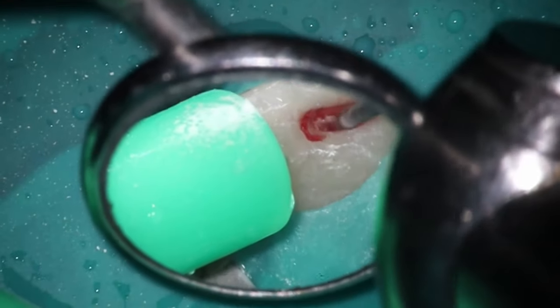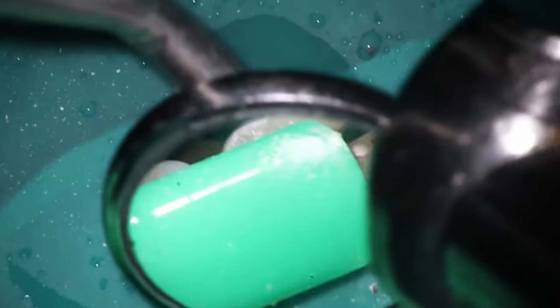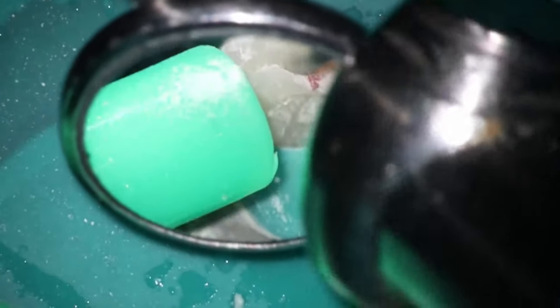And yes, I have been playing around with fusion. So here's what that looks like. You can see nice healthy tissue. It's not bleeding too much. You will notice it's not quite as solid as it would be if it had just been fresh. And I think that's because the IRM was already starting to have a little bit of a necrosing effect on that area. So I'm going to drop it down like we talked about, going in.